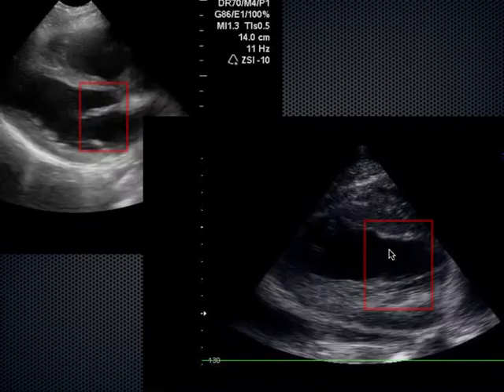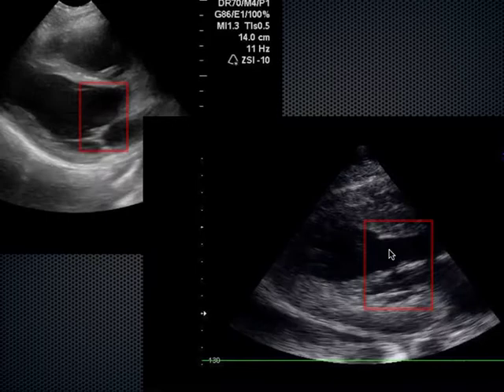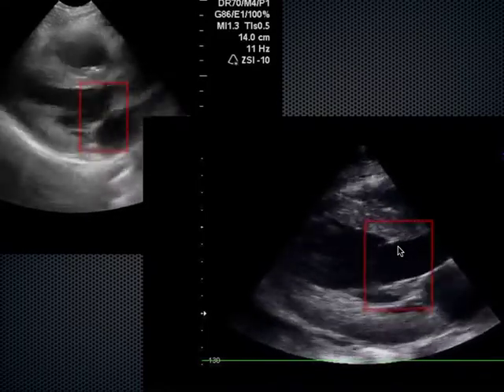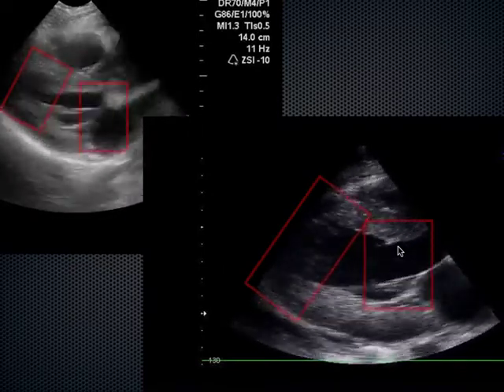And you can see, even as I freeze the image and back it up, it's really not making any meaningful headway. This is about as far as it gets, not even halfway across this opening to make its way towards the septum. So right off the bat, we're concerned about this patient having a decreased LV function, just because that valve doesn't come up and smack the septum.